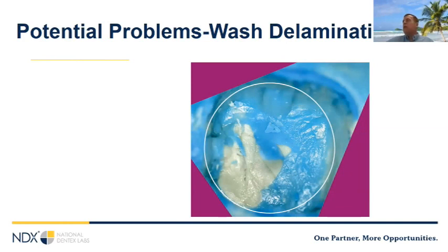This, on the other hand, is a huge problem. You should always retake these impressions. And there's a few different things that can cause this. If we use mismatched materials, or we don't do the timing properly or something like that, that can lead to this delamination. You want to make sure you use the same thing.